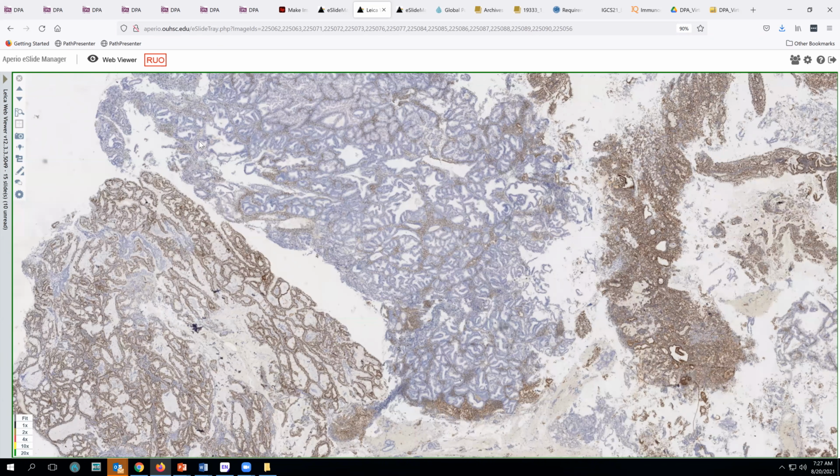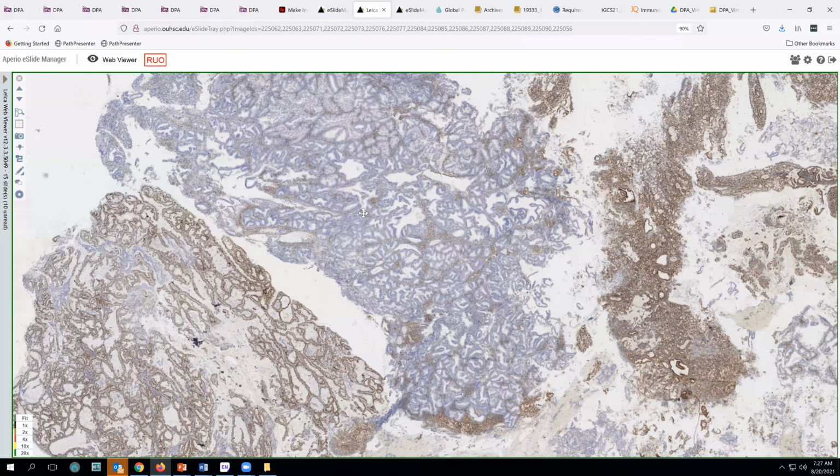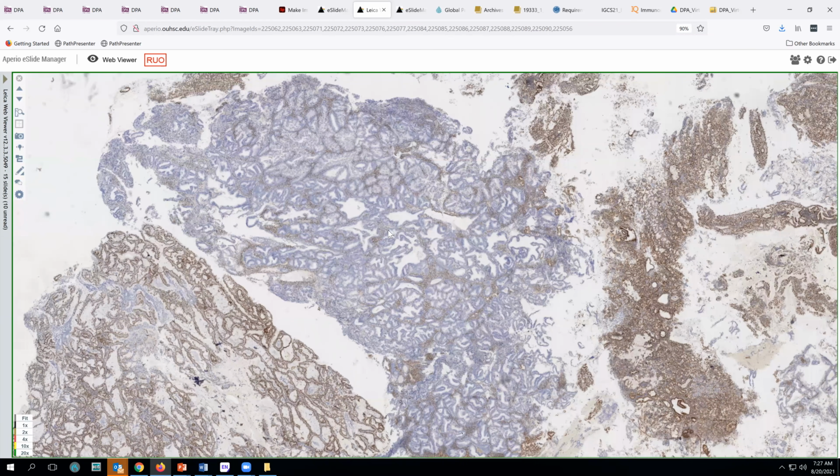And so I think if you have clonal areas like this where you have lost expression of one of these mismatch repair proteins, that should be reported as a potential indicator that there's some heterogeneity in the tumor, and that potentially these patients may be candidates for immunomodulatory therapy, because that's the main differentiator here.